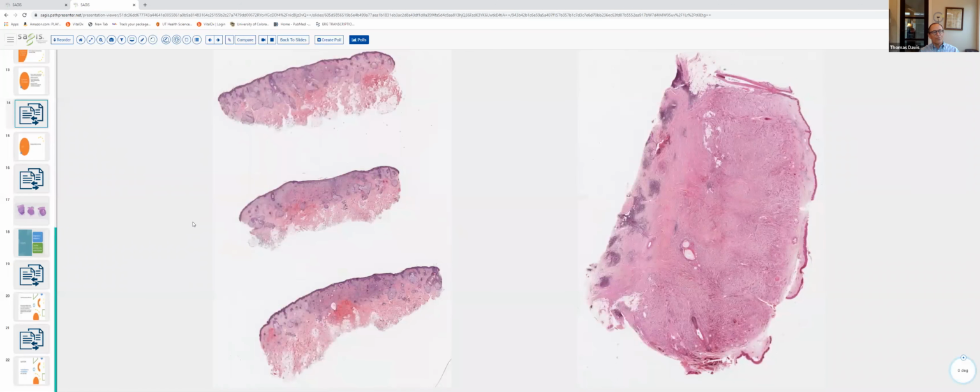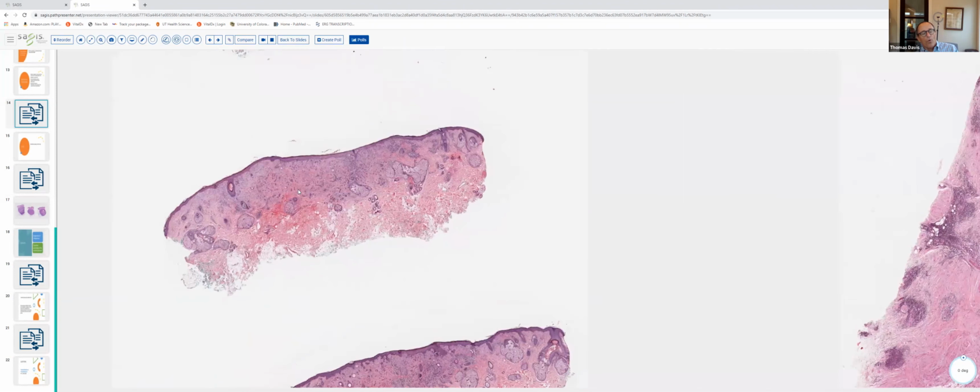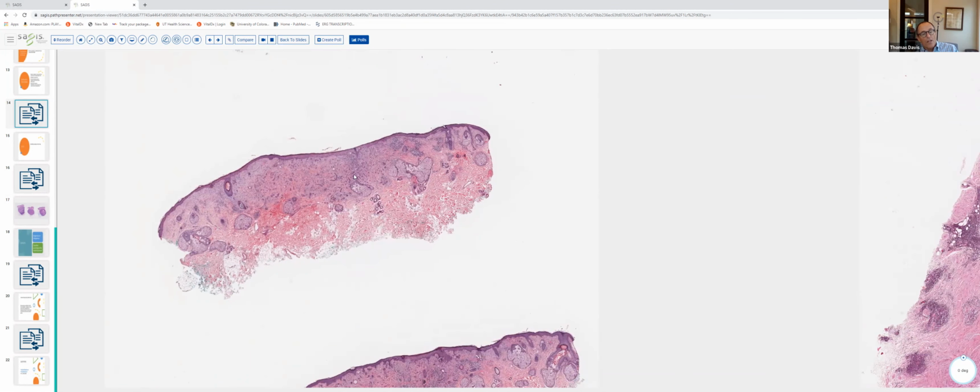So I've chosen to illustrate neoplastic skin diseases with two epithelial neoplasms. One benign on the left, a desmoplastic trichoepithelioma, and one malignant on the right. This is a microcystic adnexal carcinoma. And the more senior residents will recognize that these are both in what we call the Paisley tie differential, because in both instances, we have these narrow cords and strands of cells present within the dermis.